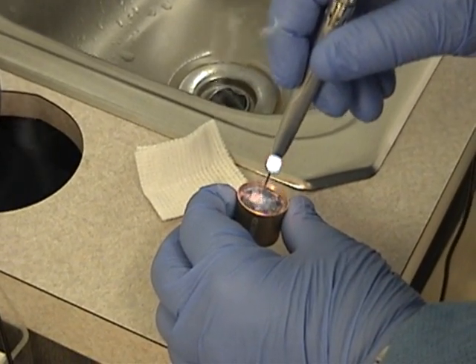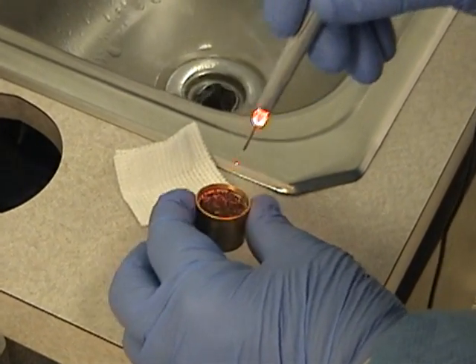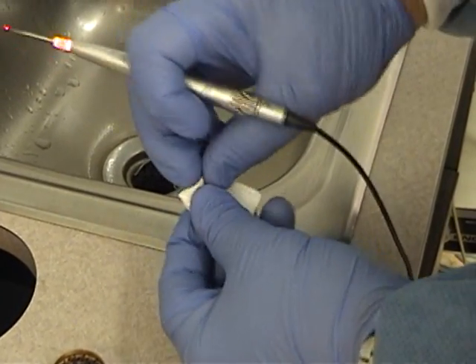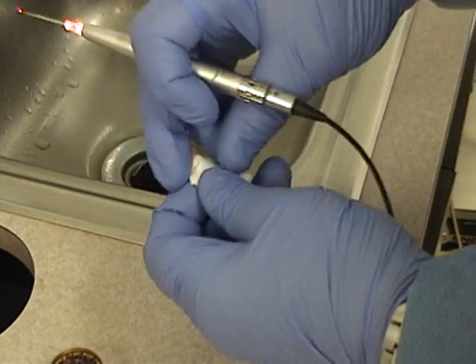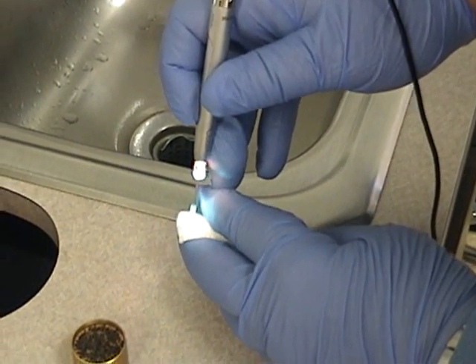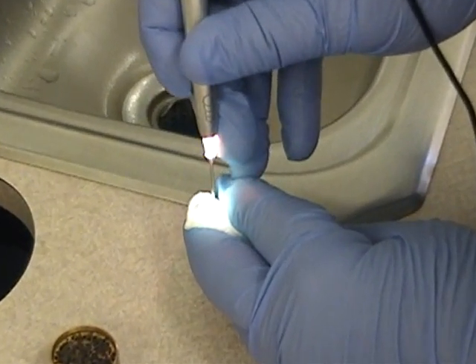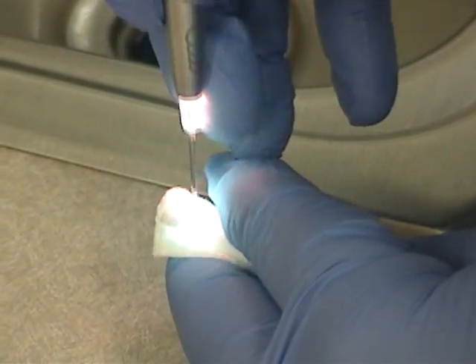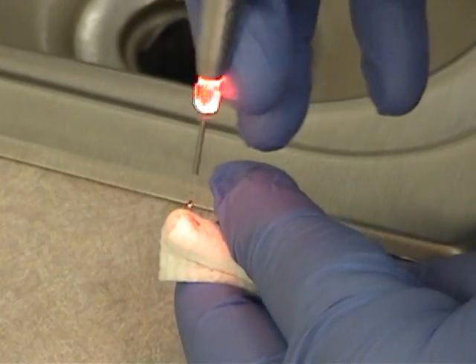We're preparing the tip — you've got to condition it. I roll it over and put it in my fingers like that, just to make sure it's going through the gauze, because this is how we're going to clean the tip. We get a little smoke going through, a little charring on the tip, and we are conditioned.